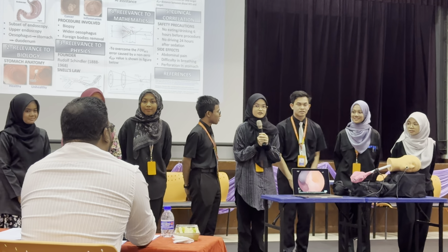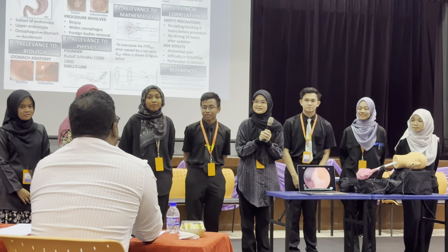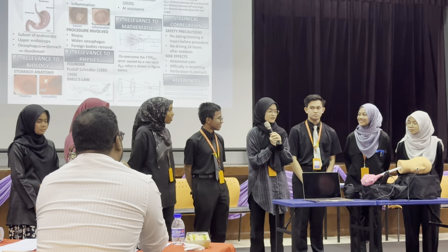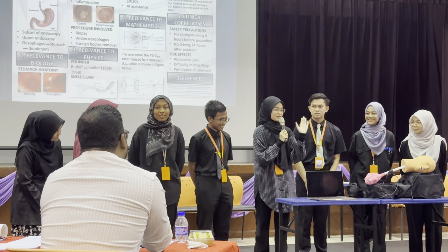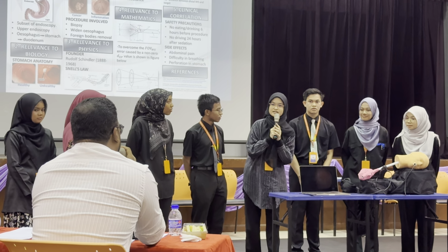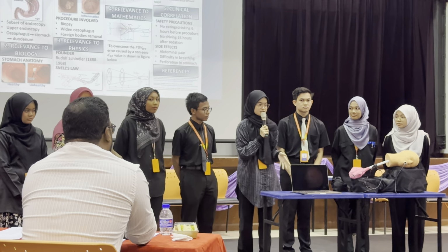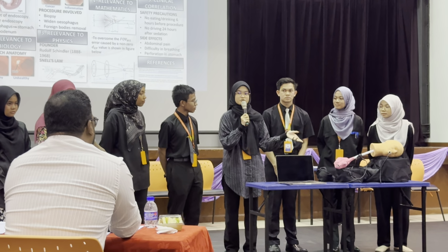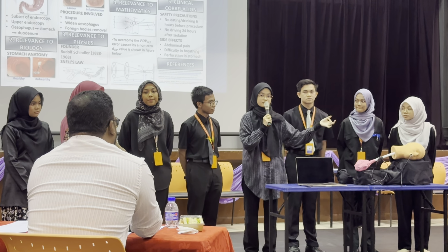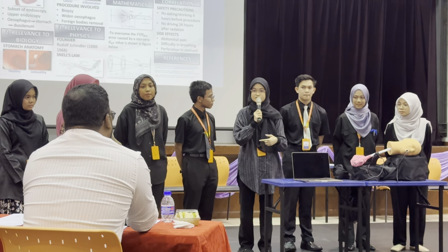Good presentation. It's a question for you. Usually, how is the patient positioned during the procedure? The patient is normally positioned lying down on the left side. This is due to many factors. It is the optimal position because the arrangement of the esophagus and stomach is the straightest there.